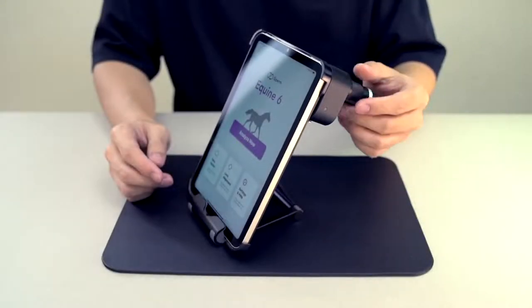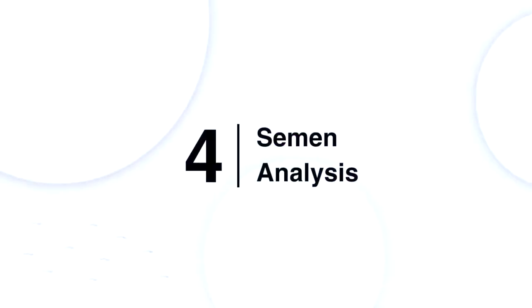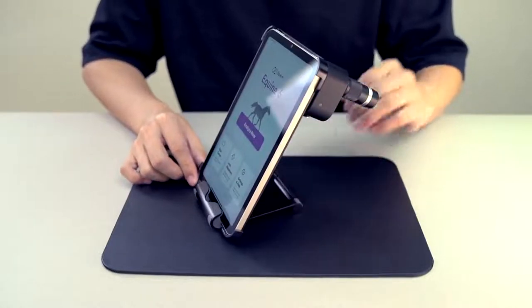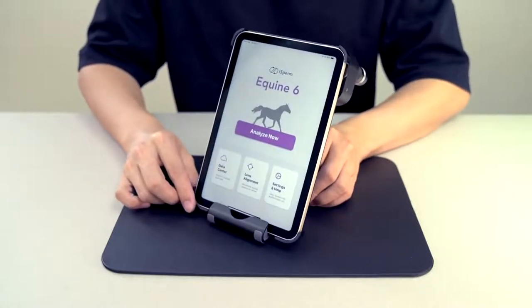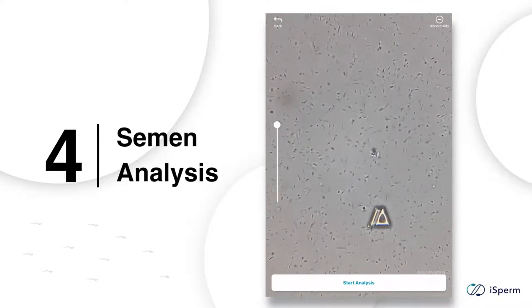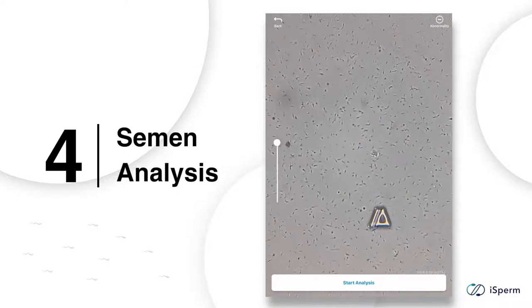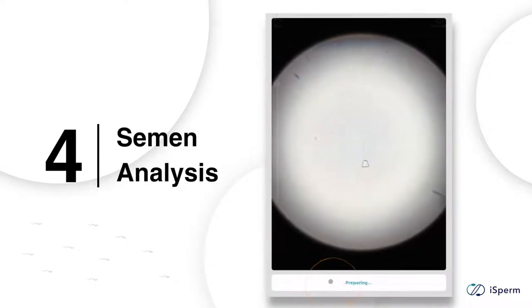iSperm is ready for analysis. This is the home page after installing the sample collector and turning the light on. Tap 'Analyze Now' to enter the analysis mode. You can zoom in to inspect the sperm cells in detail and slide the bar to adjust the focus.